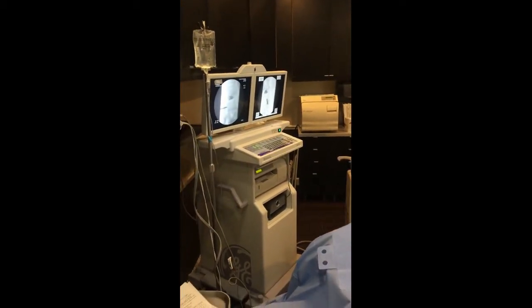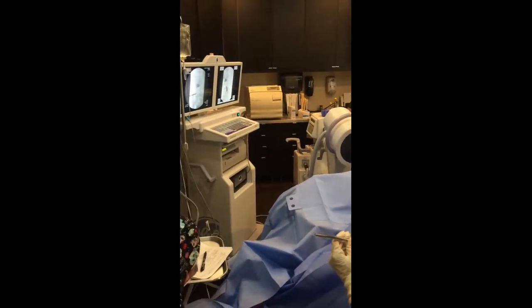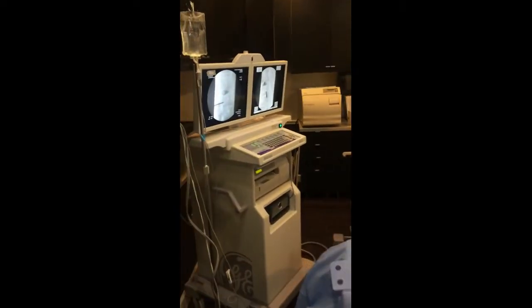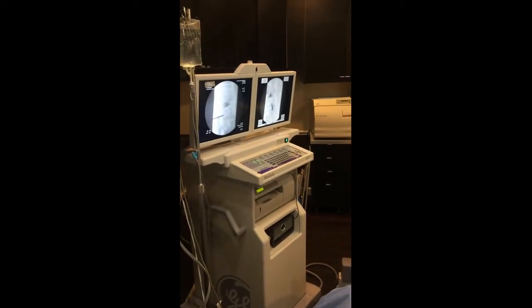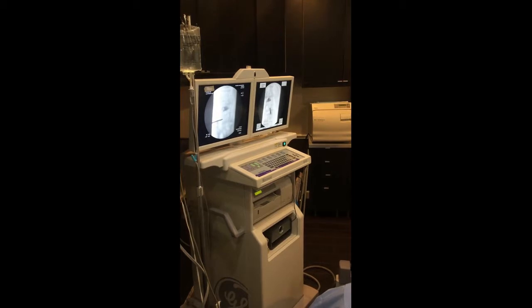Her L1 compression fracture was much worse, and I performed a kyphoplasty on it in 2015. We're now going to take a new lateral of this patient. And we've just started to enter into the vertebral body portion on that left side. So we're going to advance it a little more than it currently is.